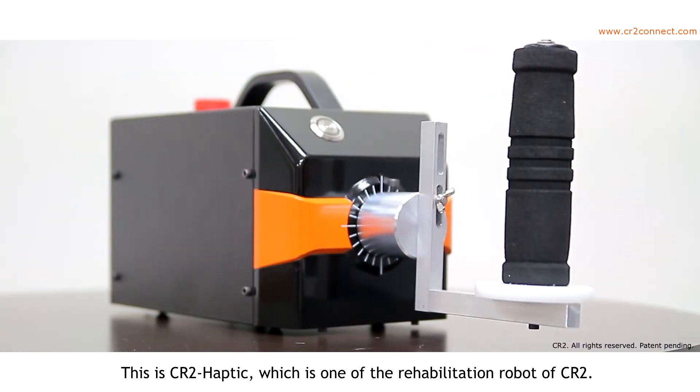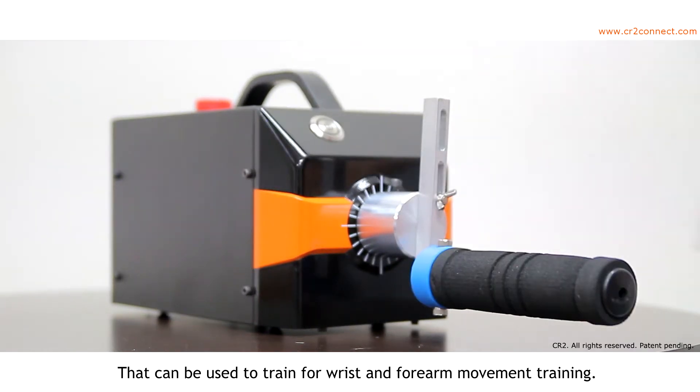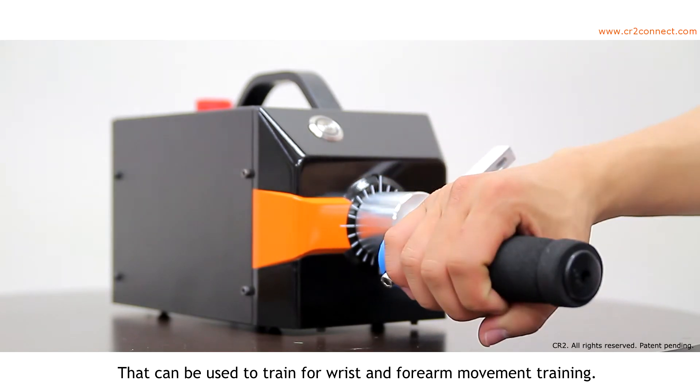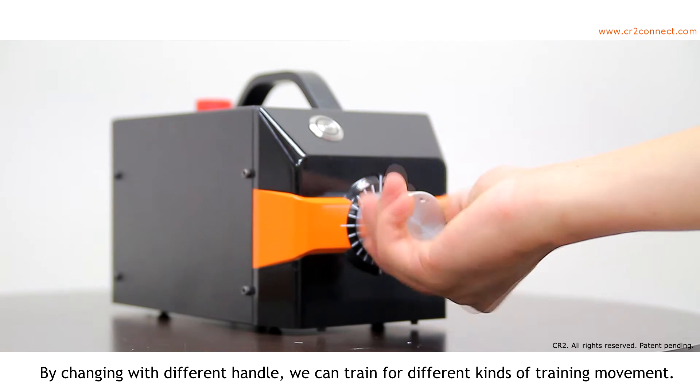This is CR2 Haptic, which is one of the rehabilitation robots of CR2 that can be used for wrist and forearm movement training. By changing to different handles, we can train for different kinds of movement.